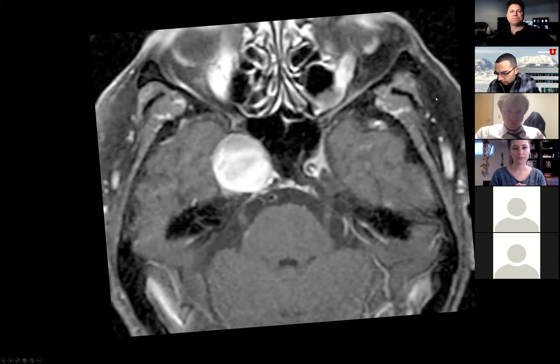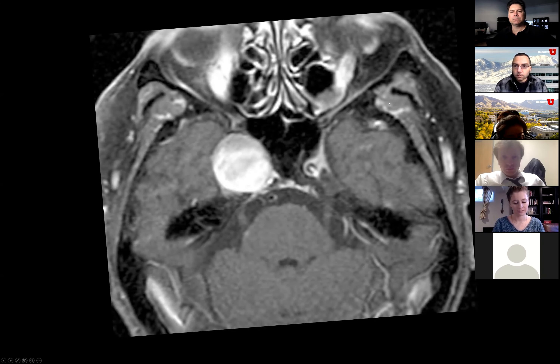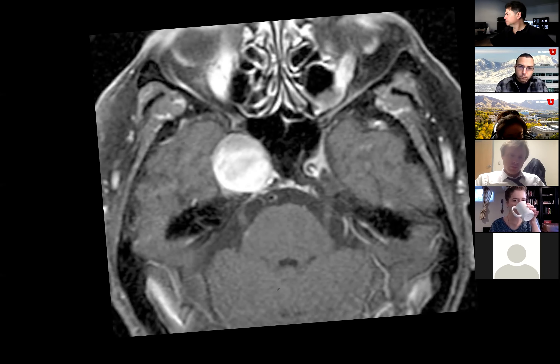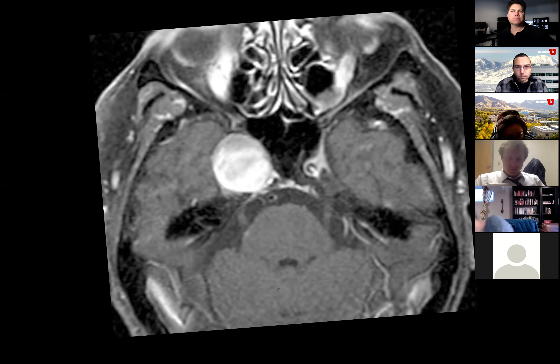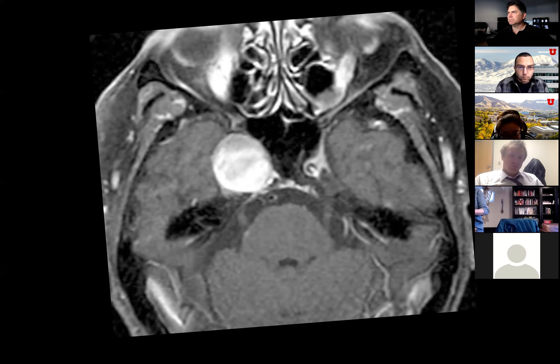On T1 post-contrast axial slice centered at the temporal lobes and sphenoid sinus, there is a well-circumscribed lesion medial to the right temporal lobe and lateral to the sphenoid sinus. It appears heterogeneously enhancing. The surrounding brain tissue does not seem angry. At this location I think about something like an aneurysm, or possibly a meningioma — though I don't see a dural tail.